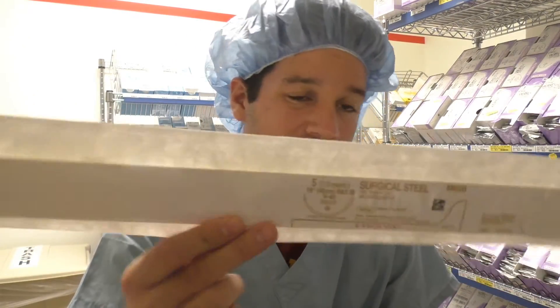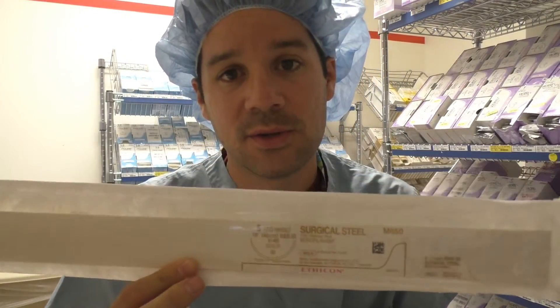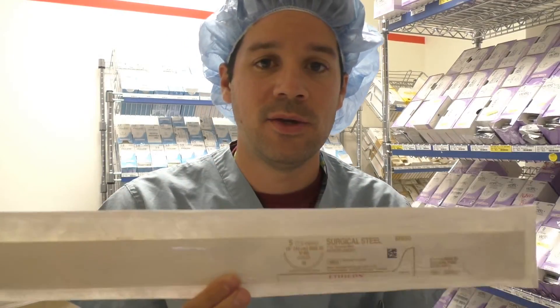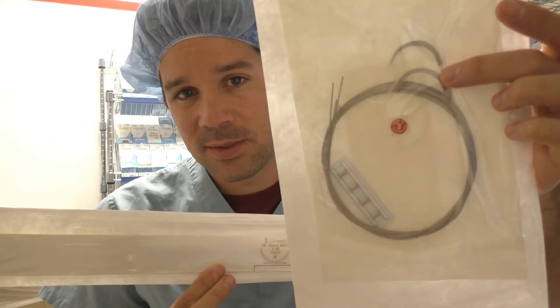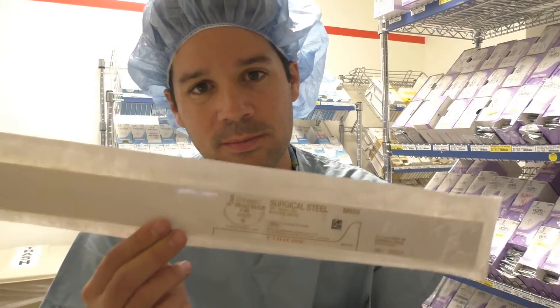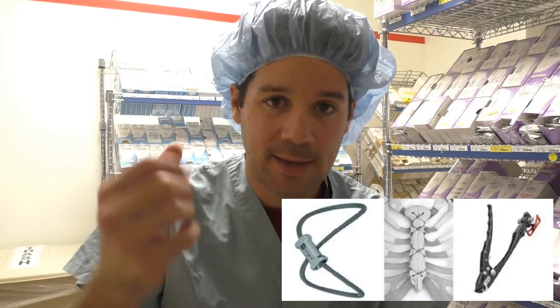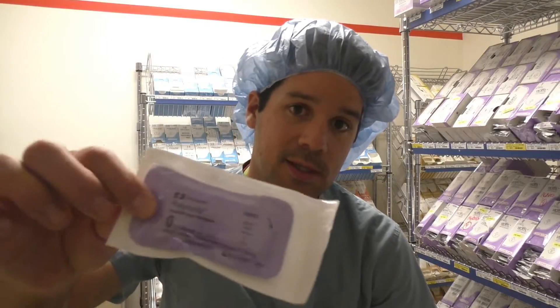Next crazy suture is this — surgical steel. Can you hear it? This is actually little steel bands that they'll use for closing up the sternum. Sometimes they use these as well — these are cables, like a multifilament of steel bands. You'll only see that used in the heart room, closing up that sternum, twisting the wires, or using a Pioneer cable system.